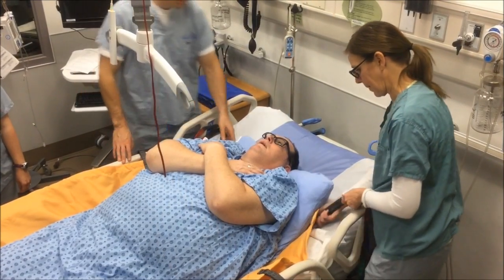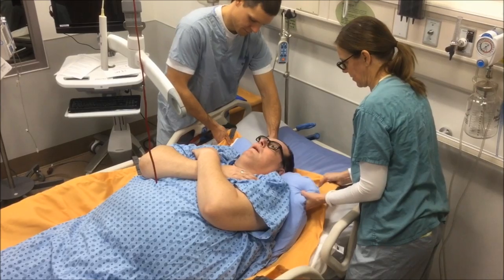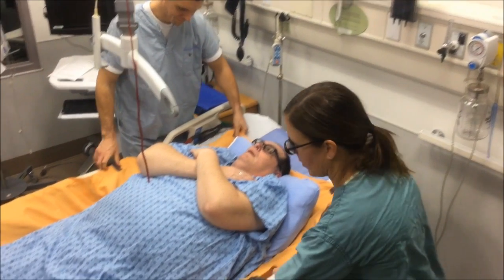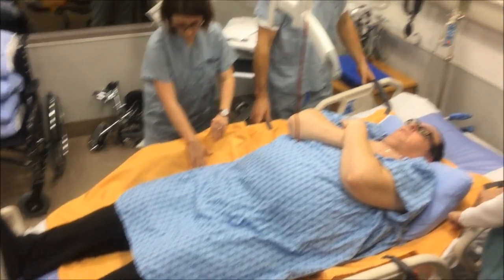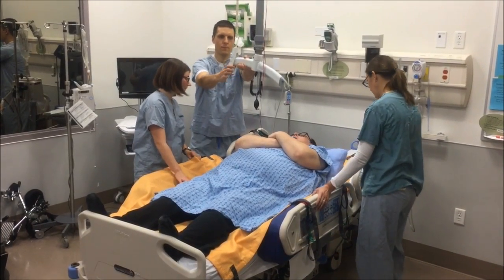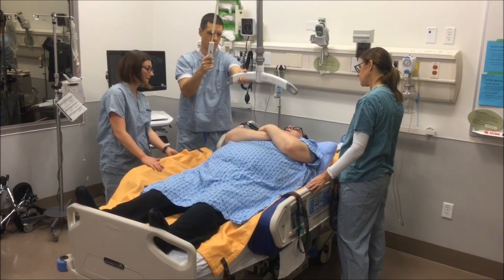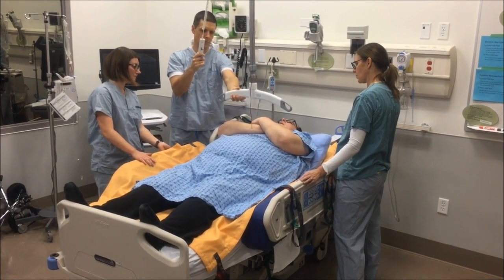If the repositioning sling is not already under the client, it can be positioned under the client using a log rolling technique or using a total lift to place the client onto a pre-placed sling. The sling should be level with the client's head, and the client's pillow remains on top of the sling. Move the lift into position, lowering the spreader bar above the client's chest, raising the height of the bed, and if needed, the head of the bed can make attaching the sling easier.